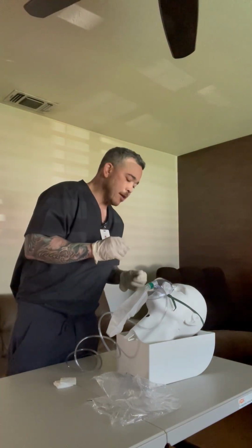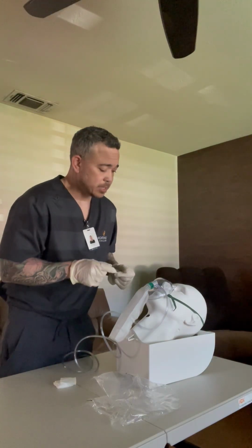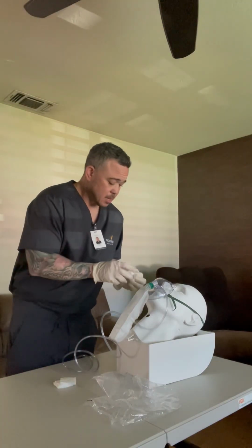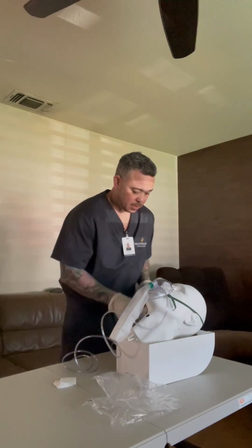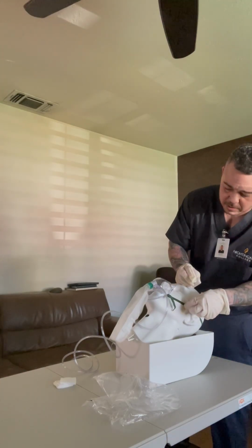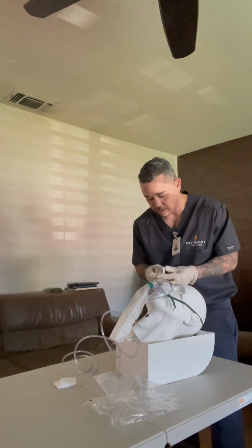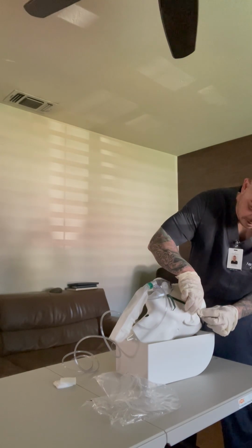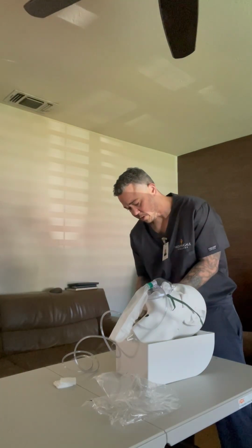What we're gonna do is every 4 hours, just like the nasal cannula, we're gonna check for skin breakdown, make sure there's no irritation or redness. However, if there is, we're gonna go ahead and put the gauze around the cheek, like how we did with the nasal cannula as well. Okay, so trying to keep my mannequin in place. Okay, as well as the ears. Do the same on this side.